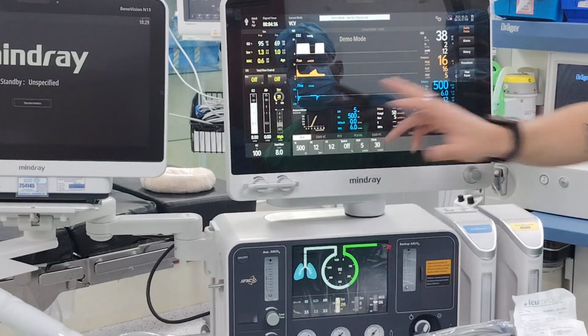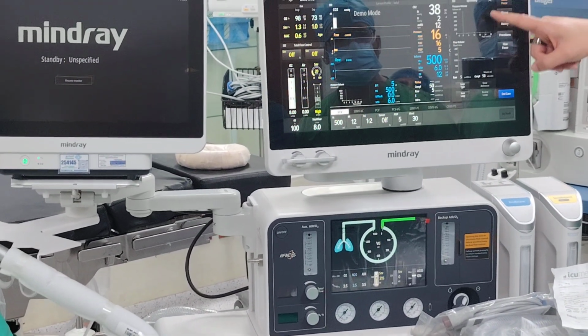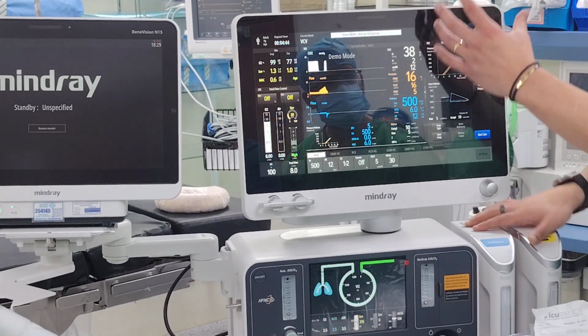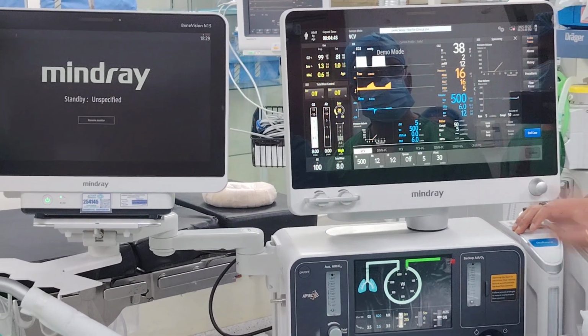Okay? So now here you have the PV loop. Very small. What you can do, click on it, boom. This now will appear. Let me show you, see? Now you can read the graphs as they are. I think it's very straightforward. But how can you utilize this function?